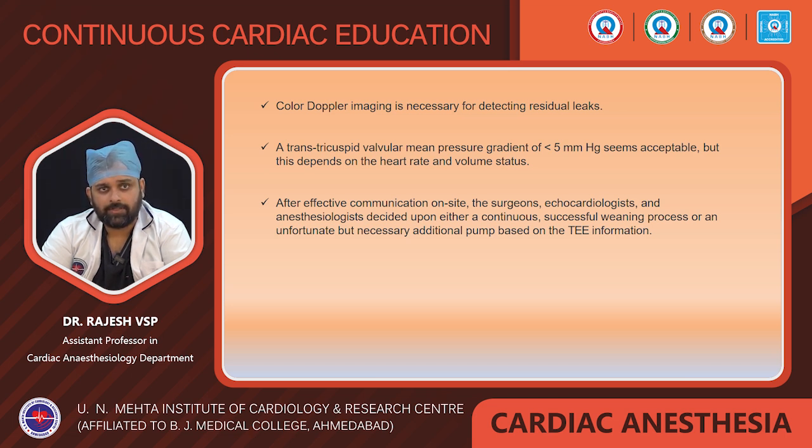After effective communication on site, the surgeon, echocardiologist and anesthesiologist decide upon either a continued successful weaning process or an unfortunate but necessary additional pump run based on the TEE information.